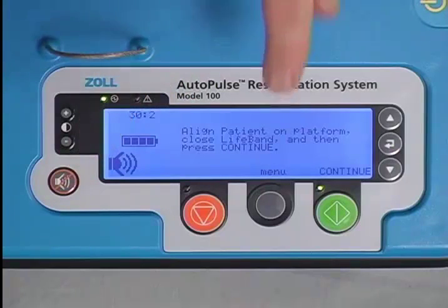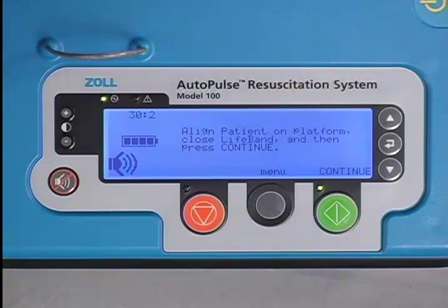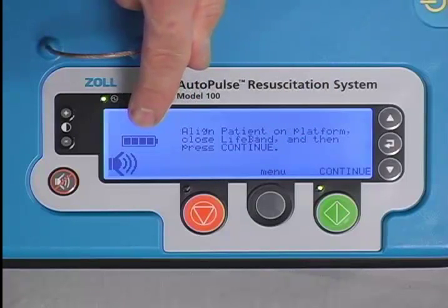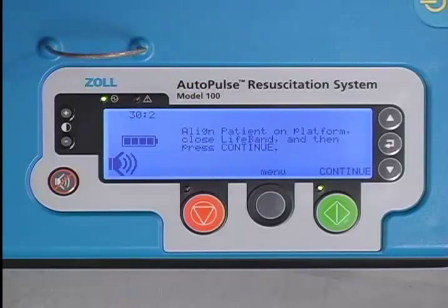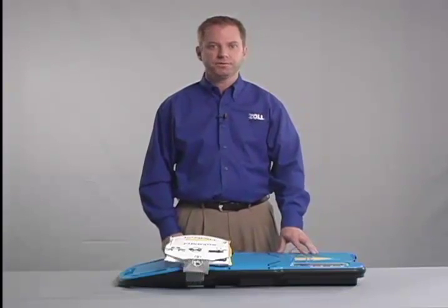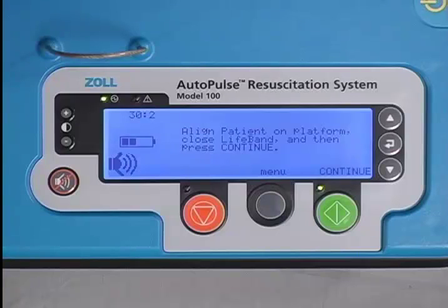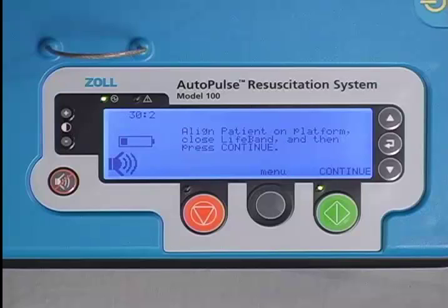The gray menu button allows the user to review information pertaining to the last patient as well as the platform and battery. The battery charge icon displays the remaining charge: 4 bars means fully charged, 3 bars means two-thirds of battery life remains, 2 bars means one-third remaining, and 1 bar means approximately 5 minutes of operating time left, indicating the battery should be changed as soon as possible.